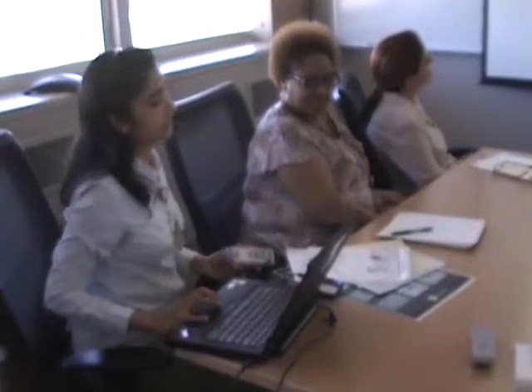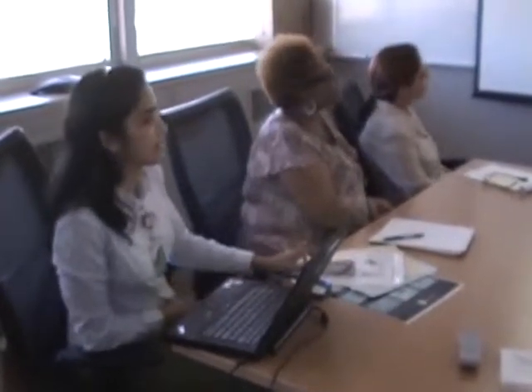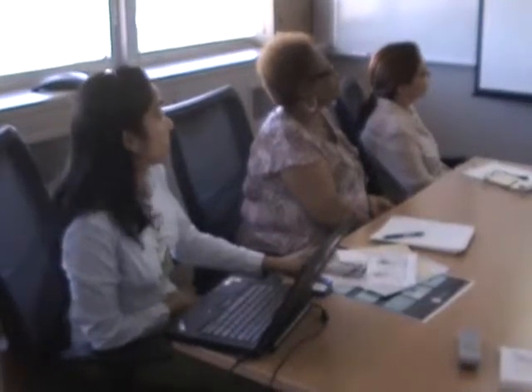If nothing works, change the scanner. And if that doesn't help and it's still having problem to scan the patient, that is the second step. Change the armband and scan the product. Anytime if you get difficulty to scan the product, always communicate that message to pharmacy so they can fix it for you. So this is the BCMA workflow that we follow in our organization.